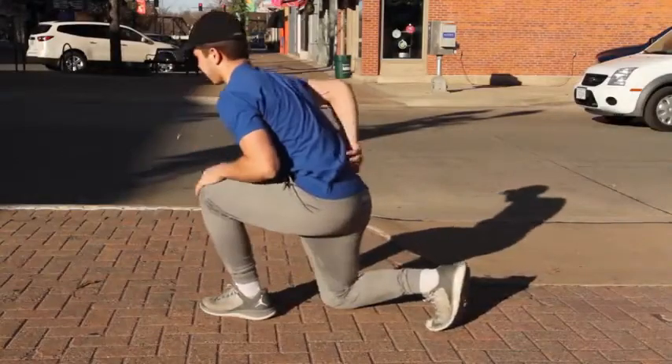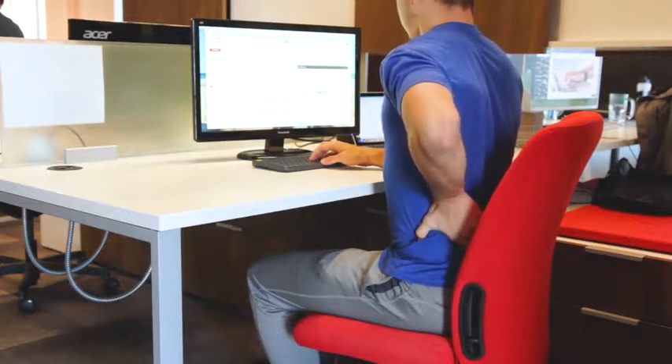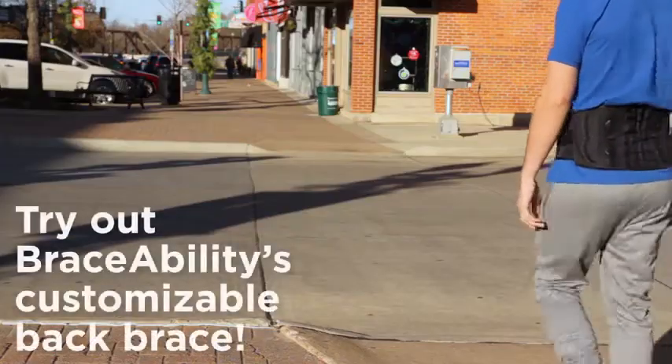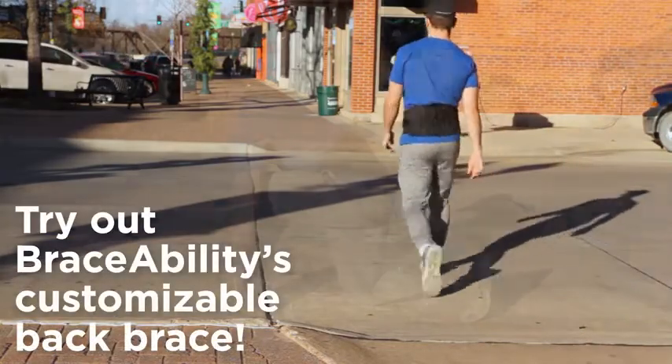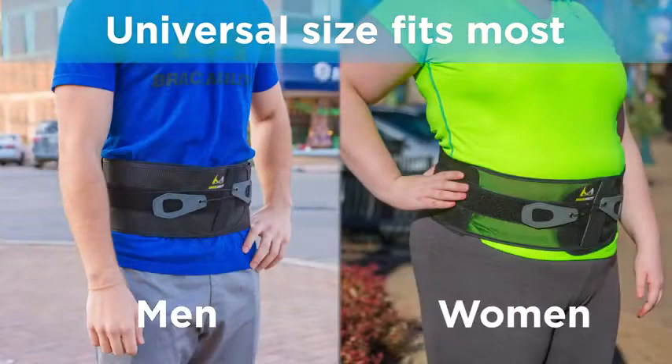BraceAbility is introducing a fully customizable back brace designed to alleviate acute or chronic low back pain, low back strains and sprains, or disc herniation. This brace will comfortably fit men and women in most any body shape.